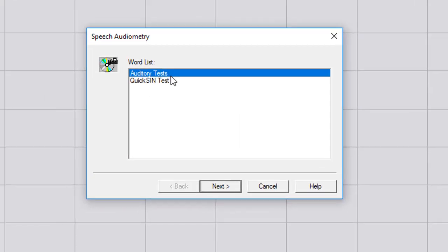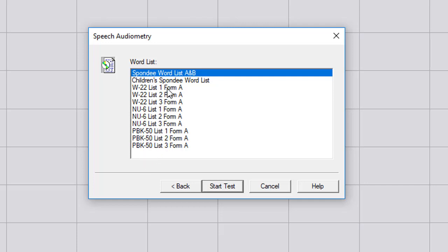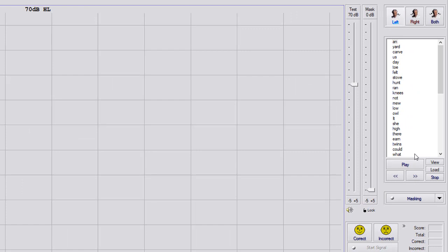The built-in word list, we click on that, go to auditory test, and then we have W22 list one, all the way down to PBK dash 50. So you can select which list you want to use, the list one form A is common.